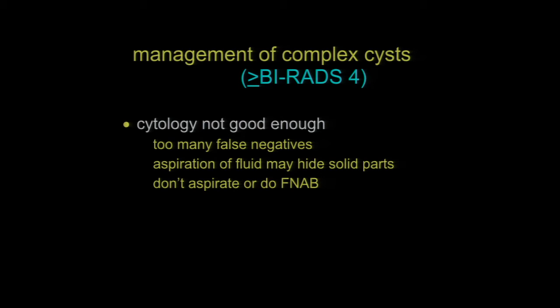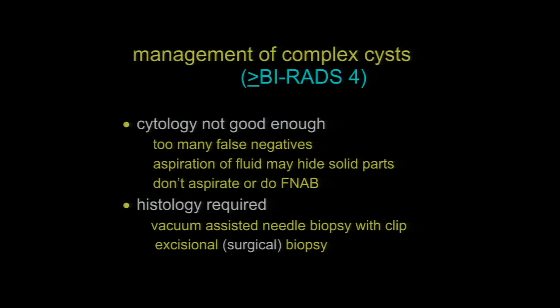Once you've decided a cyst is suspicious, cytology is not good enough. You really need histology, and I would never, ever core biopsy one of these. Every complex cyst should be vacuumed. I don't care whether they pay you or not. If you're in a freestanding clinic, they don't pay you enough to justify doing it, but there are some cases where you just need to do the right thing, and the right thing is to put the darn vacuum probe below it and vacuum the whole thing out, whether or not you get paid for it. You need to do the right thing.